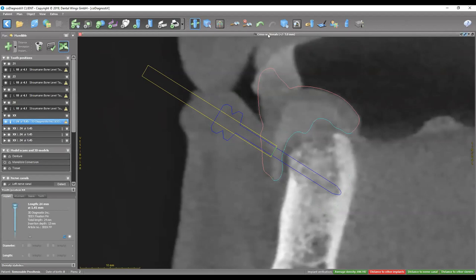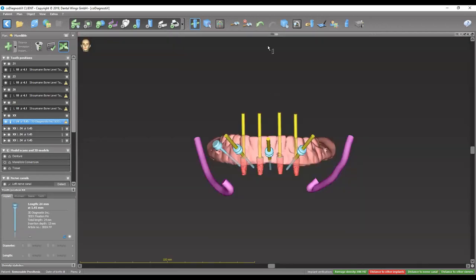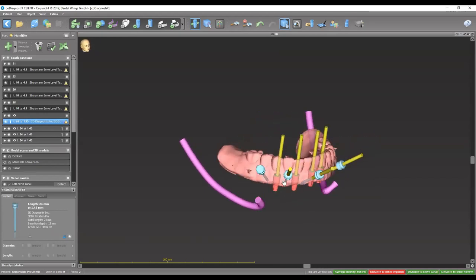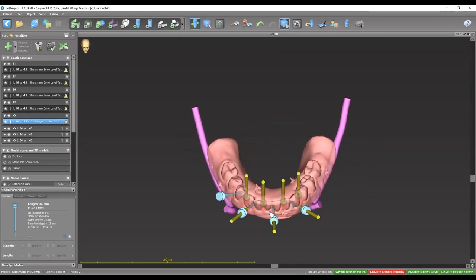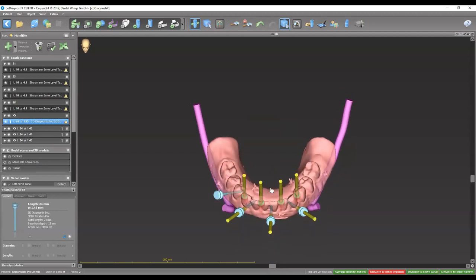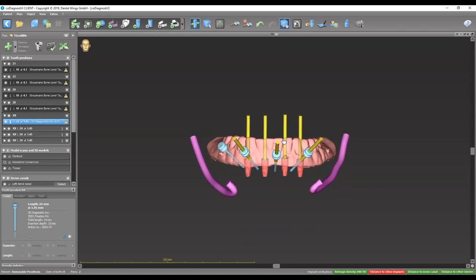We usually recommend placing more than three fixation pins — so four — placing them between the implants at a 45-degree angle. Once that's done, we go ahead and design the surgical guide after placing the sleeves for the implants. That's how to plan an overdenture in the lower arch.